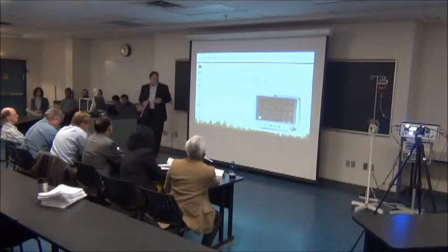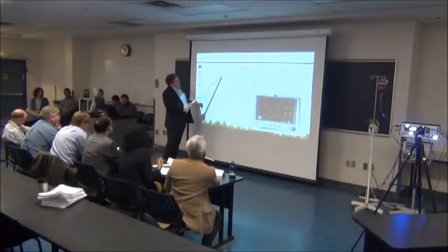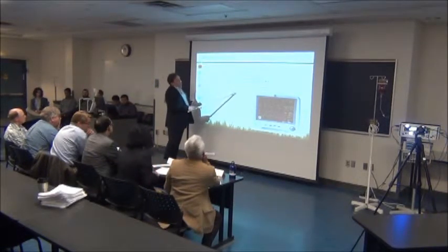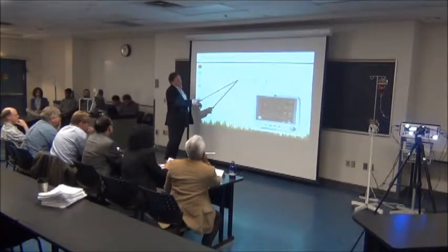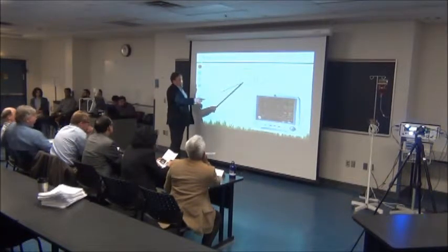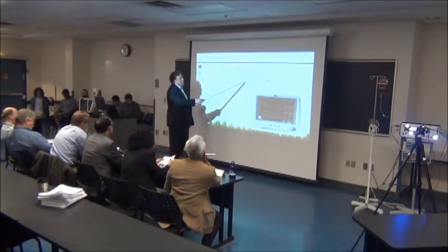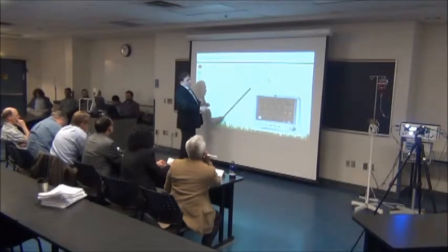Amplify and display. So that's what we want to do. So we've got the pressure wave coming from the heart through the artery to the tube. It's to the transducer. In the transducer, it's changed from pressure to an electrical voltage. Right here, the electrical voltage is very small, so it's just in a tiny voltage. And in the processing unit, it's amplified so that we can display it.